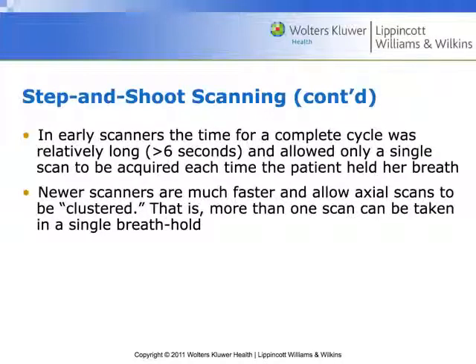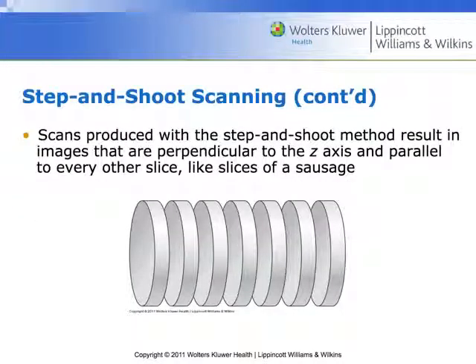And the new scans that we have are much, much faster, and when we get to our activity looking at pitch, we'll get a very real feel for just how quickly this stuff can move now. And we'll also hopefully have an understanding for why there was such a push to be able to scan faster and faster and faster, like through the 1990s. That was the big motivation. People were not as interested in dose reduction, they were interested in scanning faster. Those tables have kind of switched now.